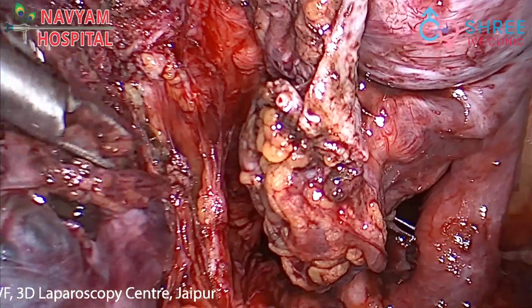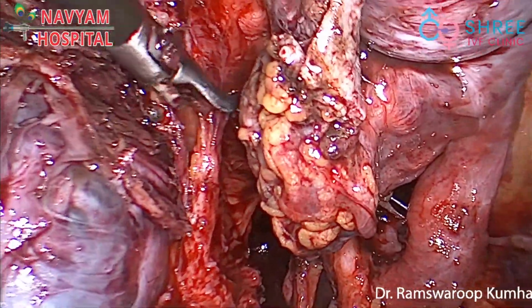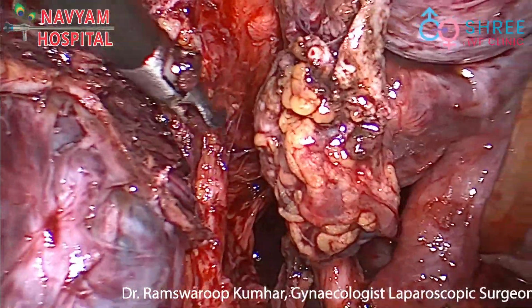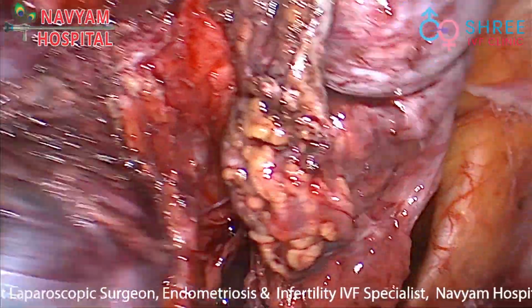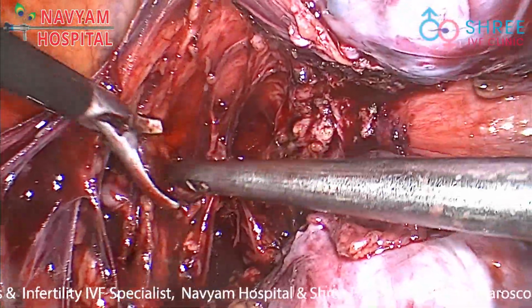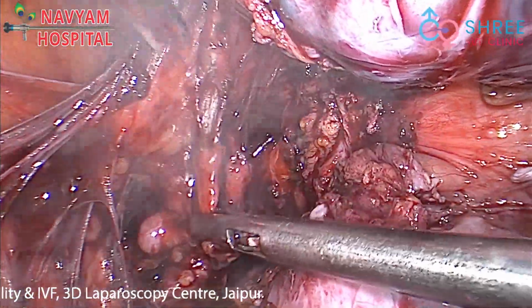For this, proper traction is being maintained for the cutting and the blunt dissection. Now we have reached deep in the pelvis and the rectum was dissected away. Now further dissection for the ureter was carried out till the tunnel, and we secured the ureter deep down.